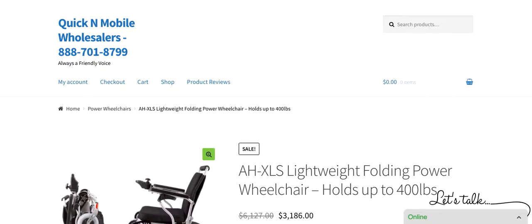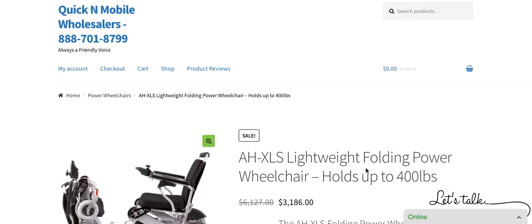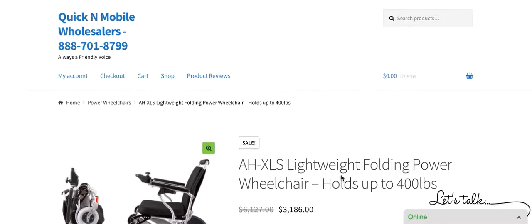Hello, in this review, we are going to be going over the AHXLS lightweight folding power wheelchair, which holds up to 400 pounds.